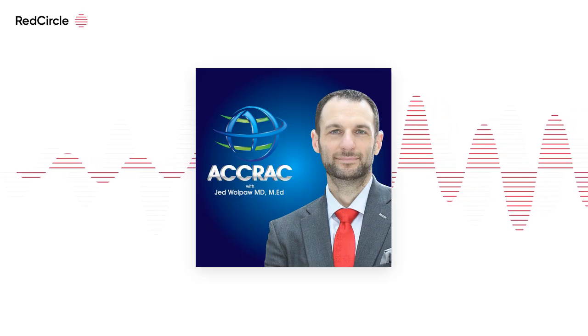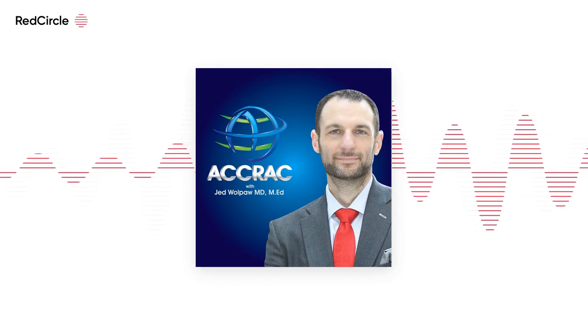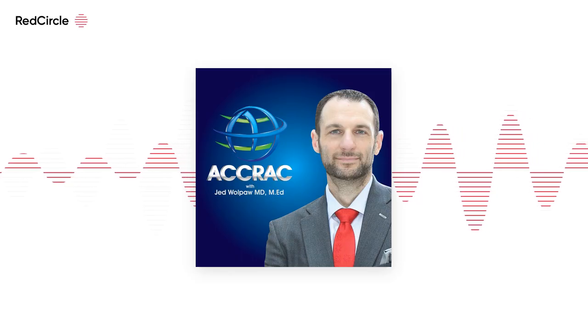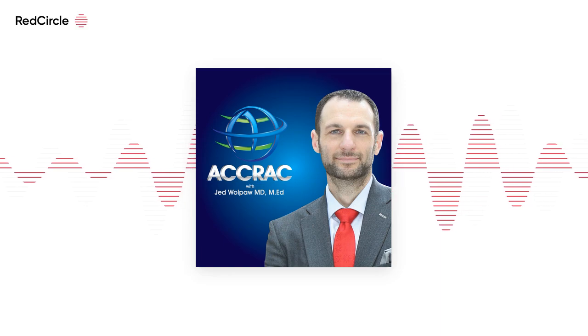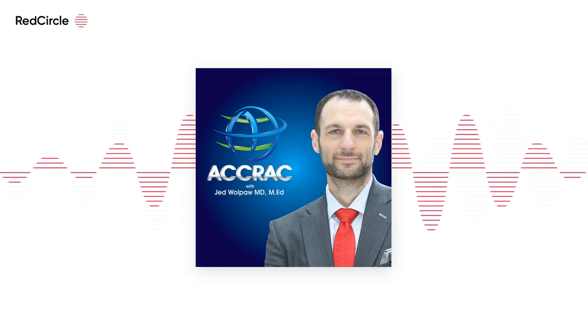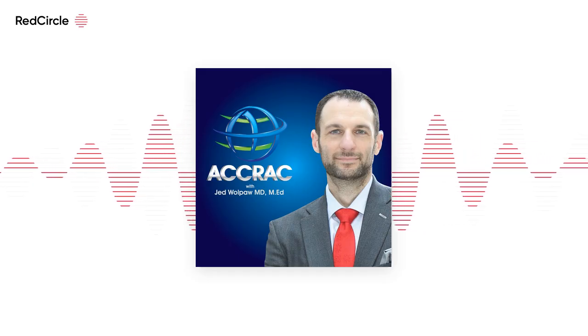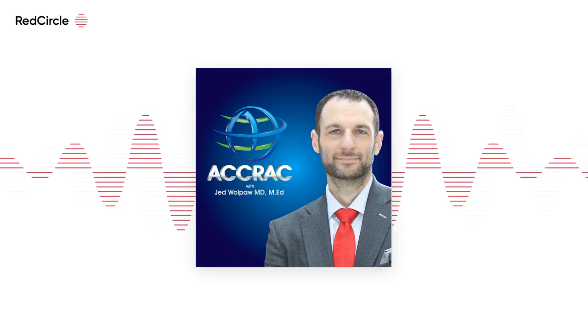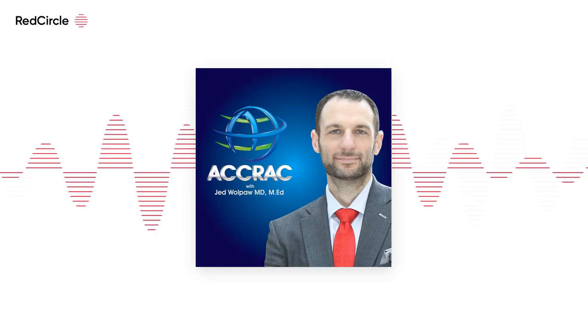Yeah, part of what this gets at is we're balancing both best oxygenation and also minimizing lung injury. One of those we can evaluate at the bedside because we can watch the oxygenation. You can't really evaluate lung injury. You've got to do a study for that, right? You've got to see where their outcomes end up. So I think we always are going to tend to believe in the things that make the SAT go up.